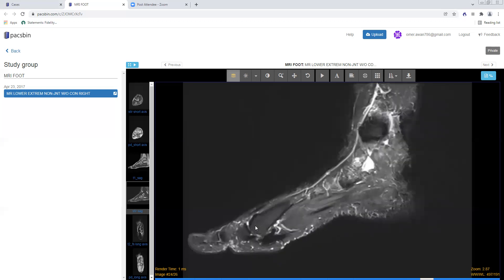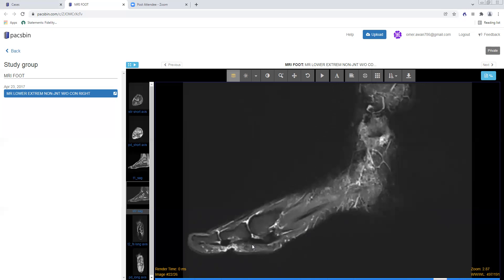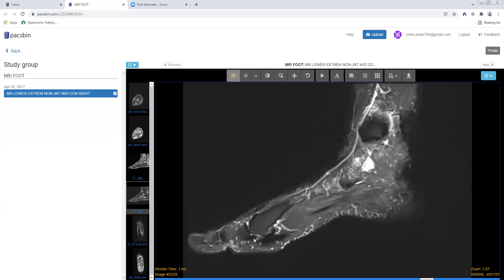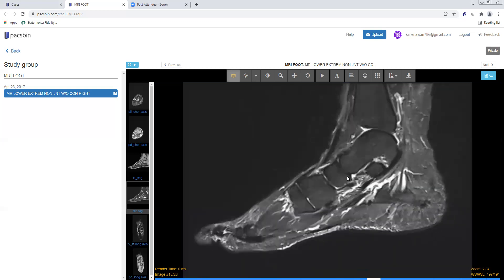On the sagittal plane you can also see the extensor tendons dorsally — the extensor hallucis longus inserts onto the dorsal base of the first distal phalanx. The flexor hallucis longus inserts onto the volar base of the distal phalanx, and the flexor hallucis brevis medial and lateral heads insert onto the volar base of the first proximal phalanx. The alignment is very good and well seen here on these images.